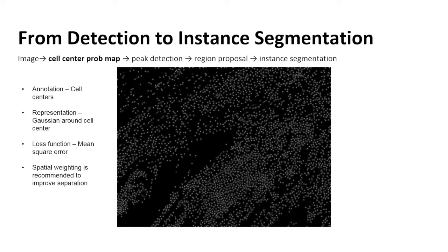The way we operate it is to have an annotation team of semi-experts guided by a pathologist, but you don't want your annotation team to work so hard in clicking all these cell centers either, which is why usually the best way to do it is a bootstrapping approach. So you have some rough algorithm. It could be a classical algorithm using thresholding that you play around with a little bit. It can be a standard, even an open source tool, or it can be a neural network that you've trained maybe on very little data at first.